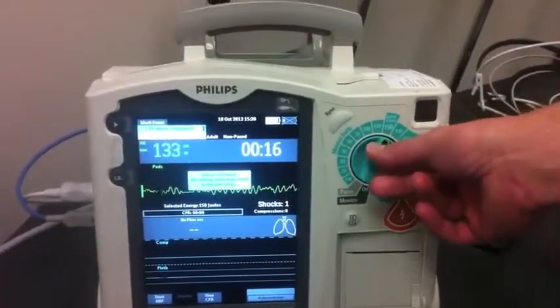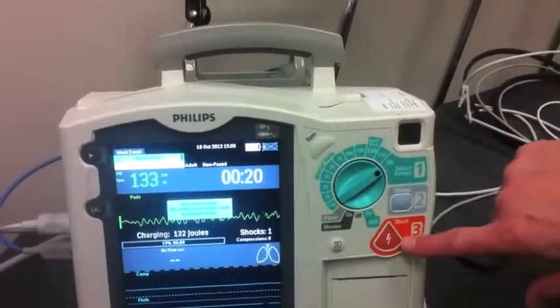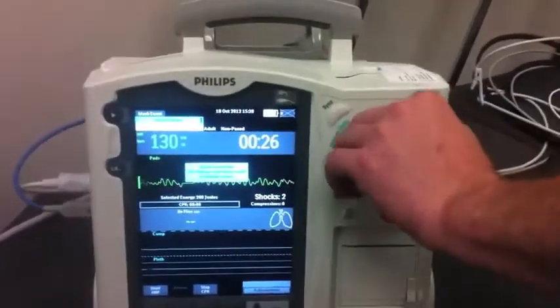We press charge and shock. You can also escalate the energy by doing this — charge, then light up the shock and deliver. That's it for manual defibrillation.